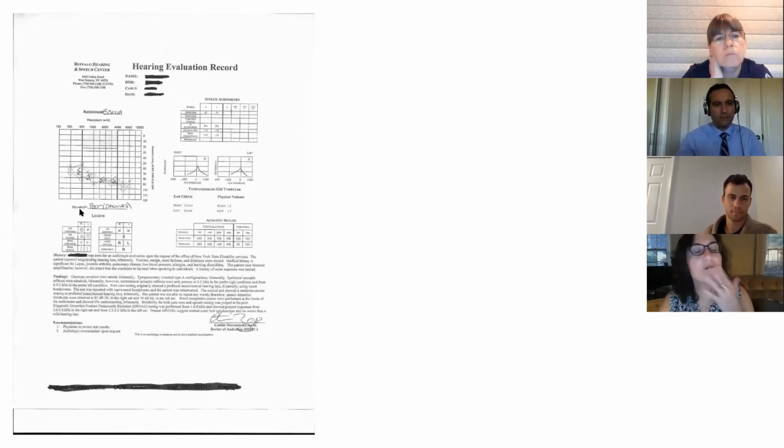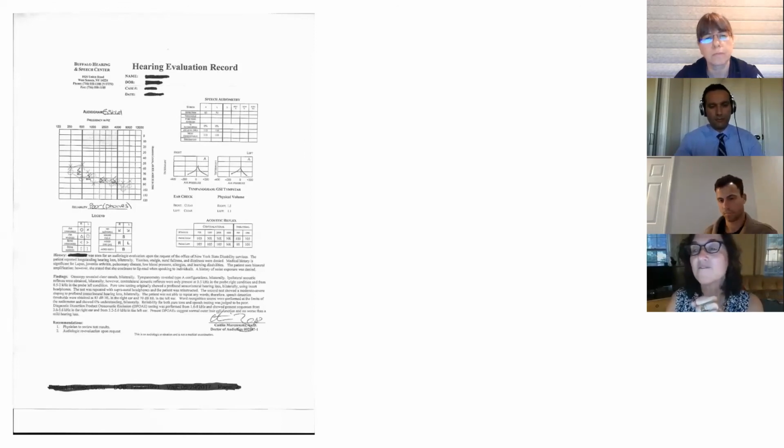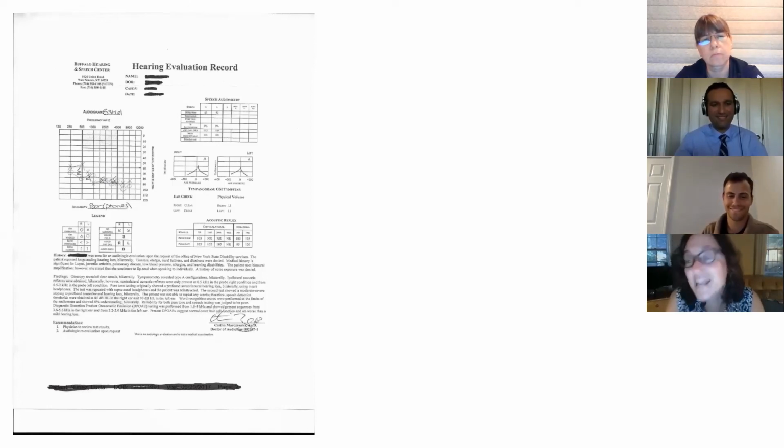This is a patient who has poor reliability. And I mentioned this before, that they wouldn't respond to any words in the word discrimination. They wouldn't respond to any sounds. They really wanted to maximally fake this. And what the audiologists sometimes will do is when they instruct them, they have a microphone, and they can make the microphone at different levels of loudness. And they'll talk to them at those quieter levels, and they'll know. And this patient was so resistant to giving the audiologist any response that she used otoacoustic emission testing, what we use in a newborn. And they had normal reflexes. They had normal otoacoustic emission testing. They were just faking it. So what I tell my patients is, do your best on these tests because they're going to know. And it kind of scares them into really making an effort on their hearing tests when there's a secondary gain of some sort.